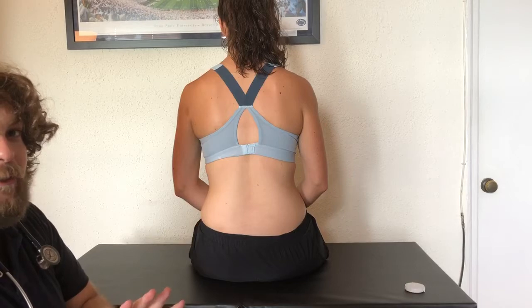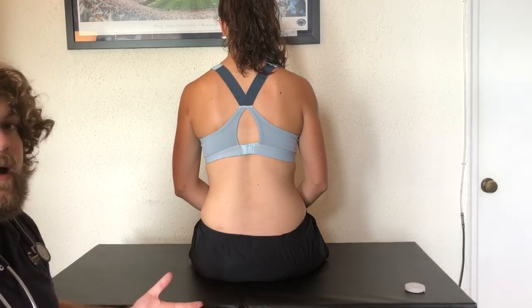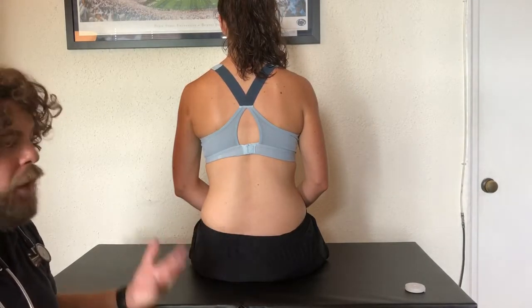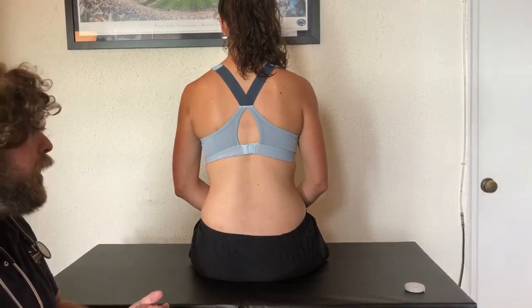Again, in the intercostal spaces, we're not listening over the ribs. And again, depending on the patient's clothing, we may have to listen a little bit over it. Depending on the comfort level, we can maybe listen slightly under it, under the edges.